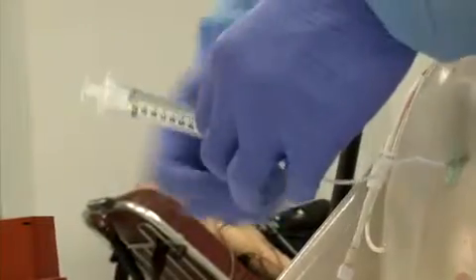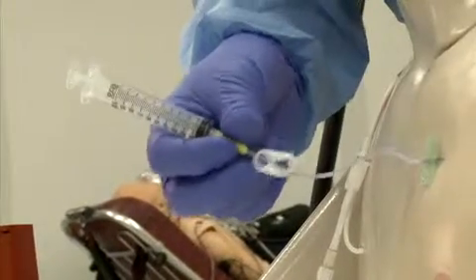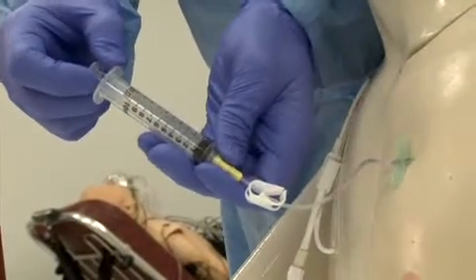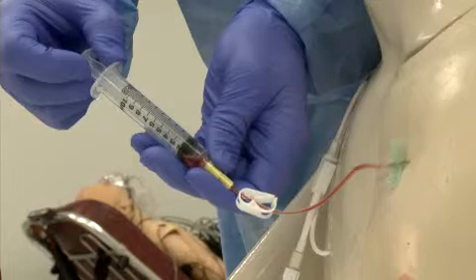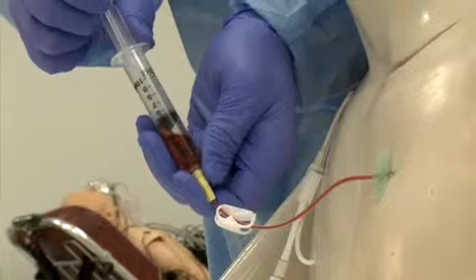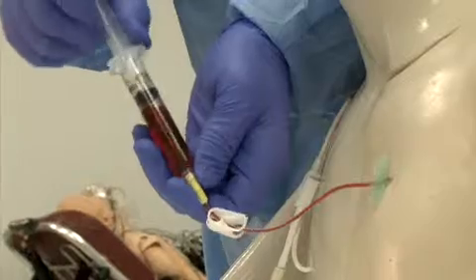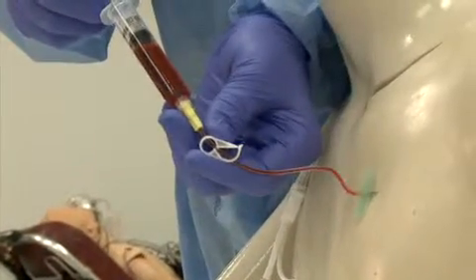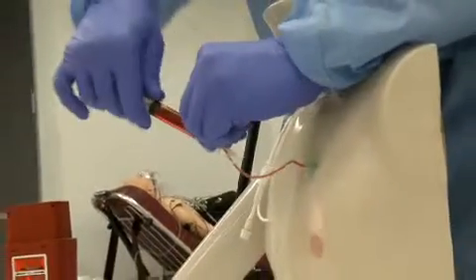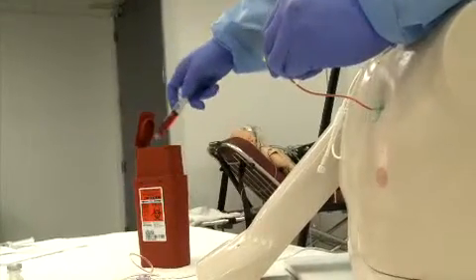Open the clamp and withdraw 5 to 8 cc's of blood, then re-clamp and close the catheter. Remove the syringe and discard safely. Then attach the saline-filled syringe.